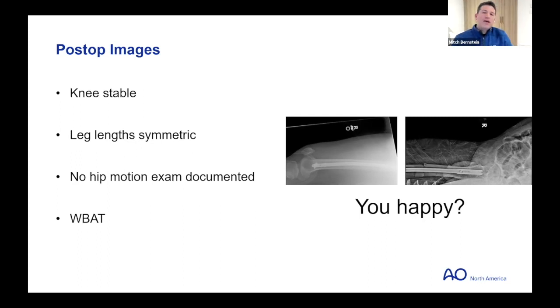I mean, if I'm not happy, or I suspect that there's a rotational deformity, in this case I might just do a lesser trochanter profile from the other side. But if I'm out of the OR, I'll quantify it with a CT scan, speak to the patient, and at least determine it. But again, my mistake in my case was I was overconfident, and I didn't even think about it, and I didn't look out for it.